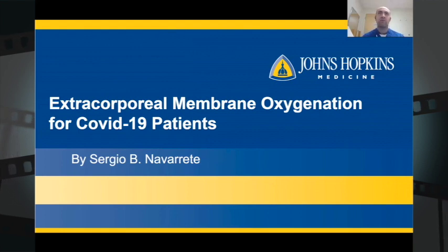Good afternoon, everyone. My name is Sergio Navarrete, and I will be presenting on extracorporeal membrane oxygenation, otherwise known as ECMO, for COVID-19 patients. In this presentation, I'll focus on veno-venous ECMO for respiratory failure. As many of you know, there is veno-arterial ECMO that is often for shock or cardiogenic failure.